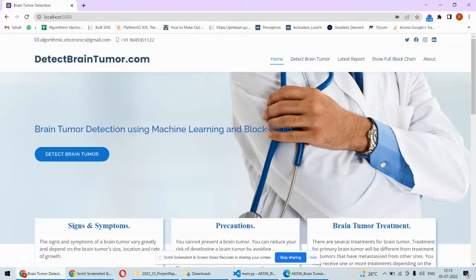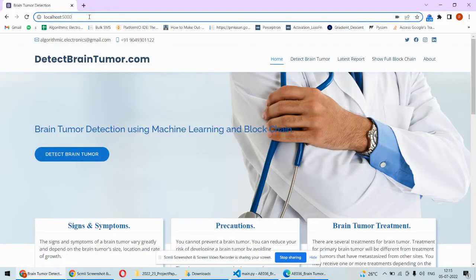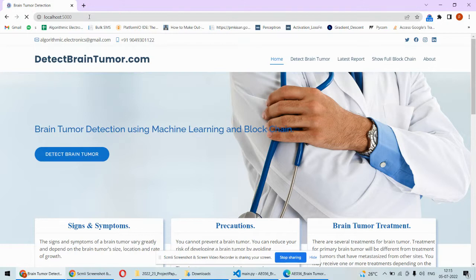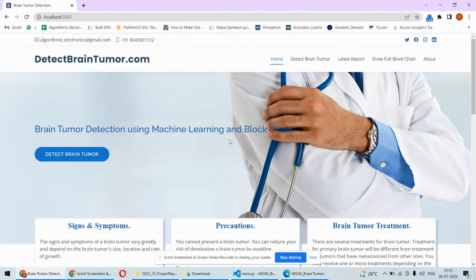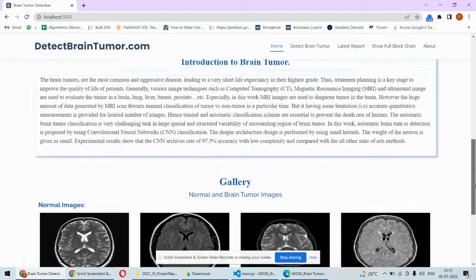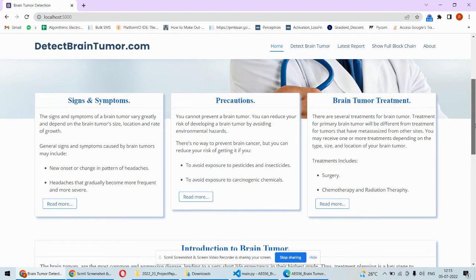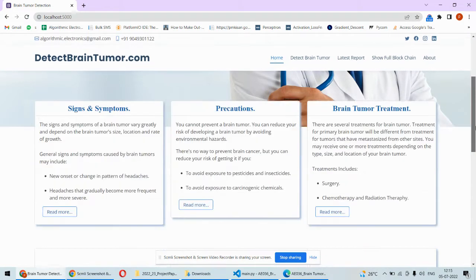We can type localhost colon 5000 in the browser so that we will be able to open this kind of interface. In the front page we are having some basic study information, that is signs, symptoms, precautions and all those things regarding the treatment.